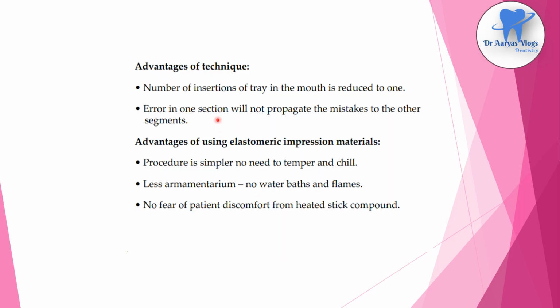And what are the advantages of this technique? Number of insertions of tray in the mouth is reduced to 1. That is very important, and that is very important advantage. Error in one section will not propagate the mistakes to other segments.